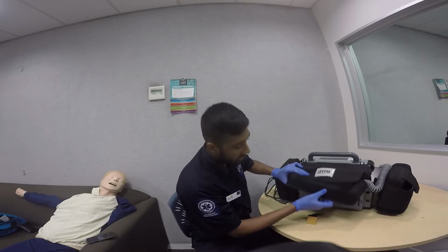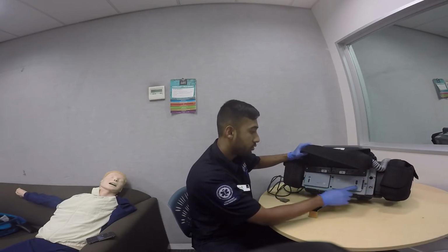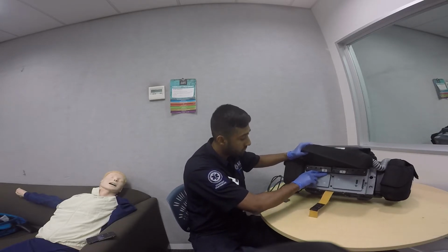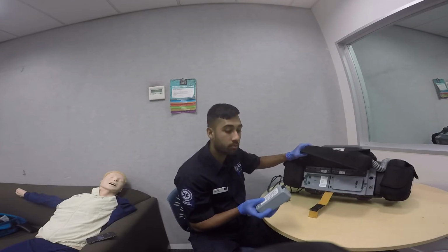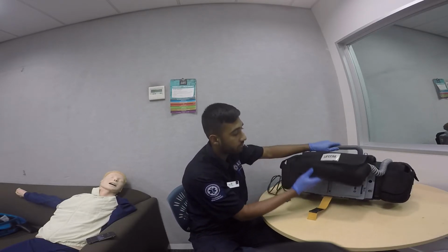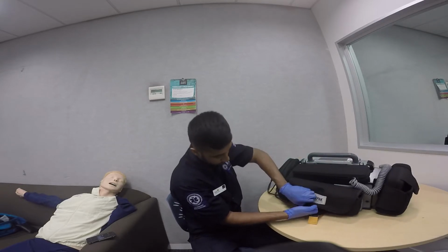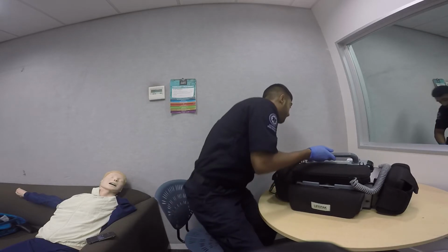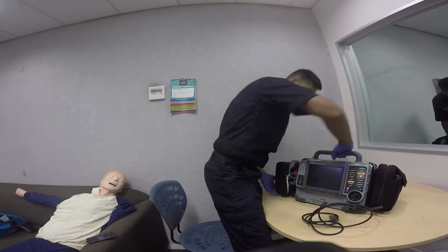To check the battery for the LifePacks, what you can do is press the two buttons. It should indicate the battery. If we need to replace it, just pull the tab and you can charge or replace the battery if needed. Click that into place, pop the tab down and fold over like so. Alright.